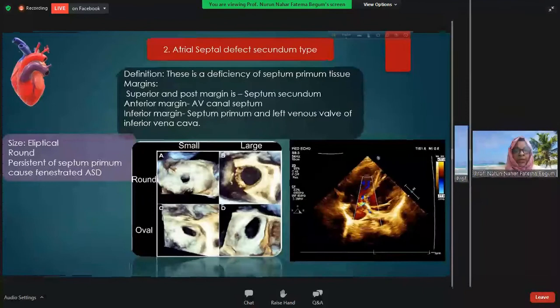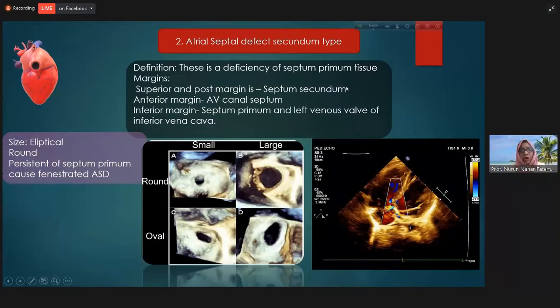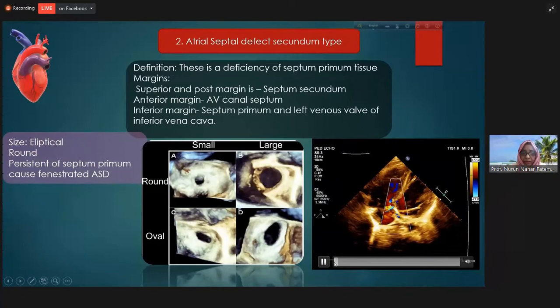The secundum type ASD is a deficiency in the septum primum, which is usually on the left atrial side. This is very important. The size of this defect may be round or elliptical, and we can see this from echocardiography.